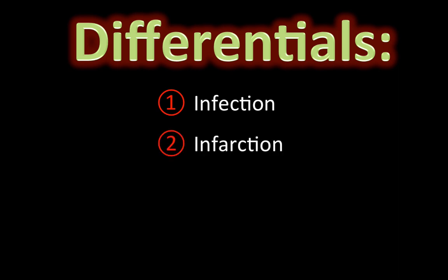Now, infarction, which is a very common clinical question, does not appear like this. For infarction to involve multiple areas, that would be less common and usually is a result of a cardioembolic stroke or vasculitis. The location of the medial temporal lobes bilaterally is unusual, and the classic differentiating point between herpes encephalitis and infarction is that herpes classically spares the basal ganglia.